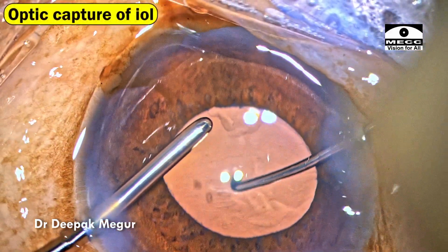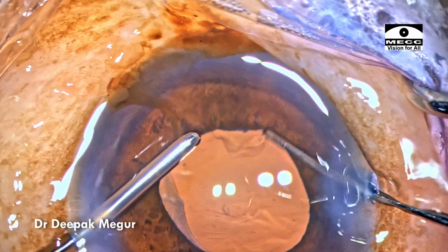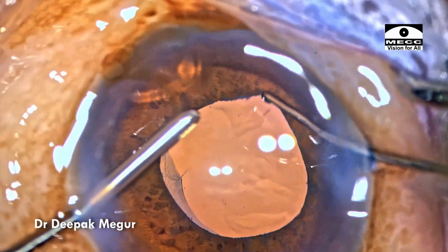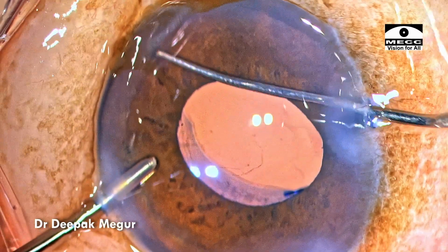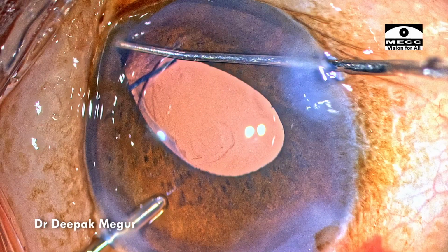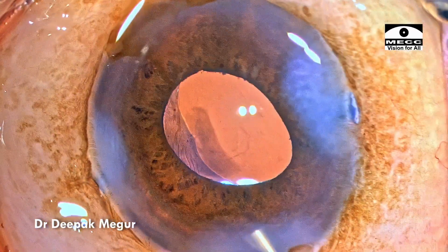With the irrigation in my left hand, the optic of the lens is gently tapped posteriorly so that it gets trapped in the rhexis margin. I'm going to use a hook to retract the iris and to confirm the same. The ovalization of the rhexis is a sign that we have achieved optic capture. The wounds are hydrated, and that's it, the case is done.